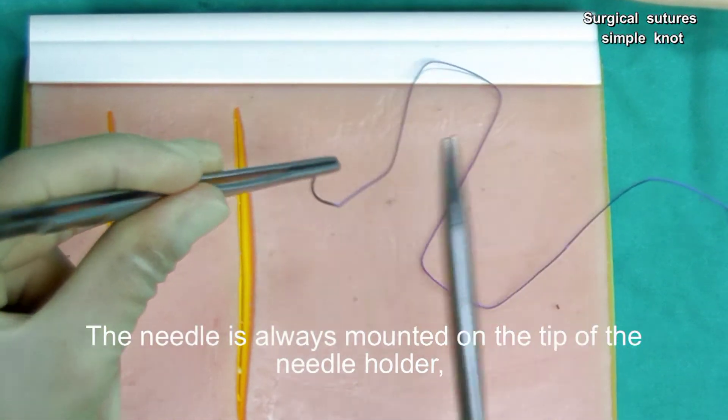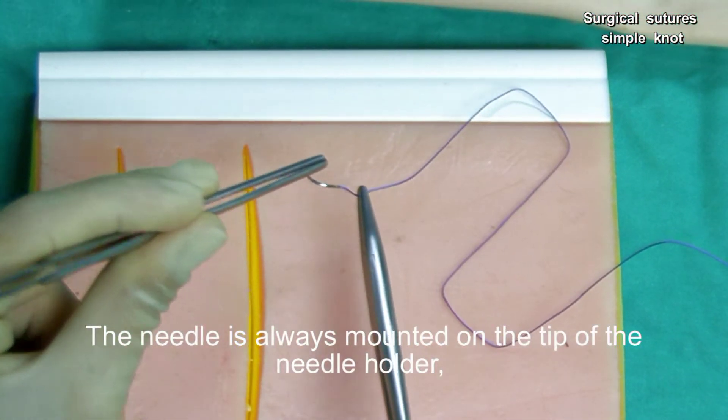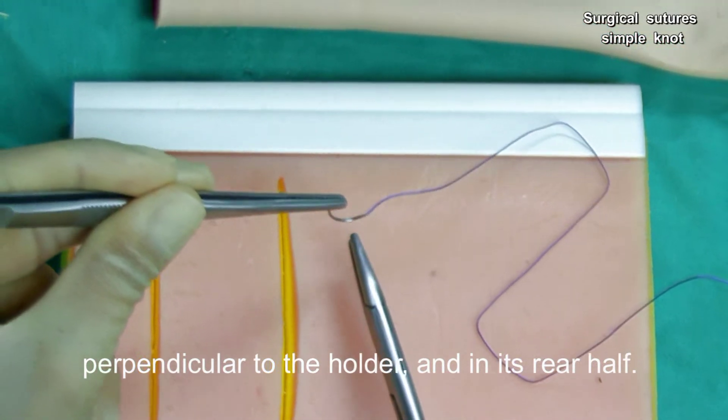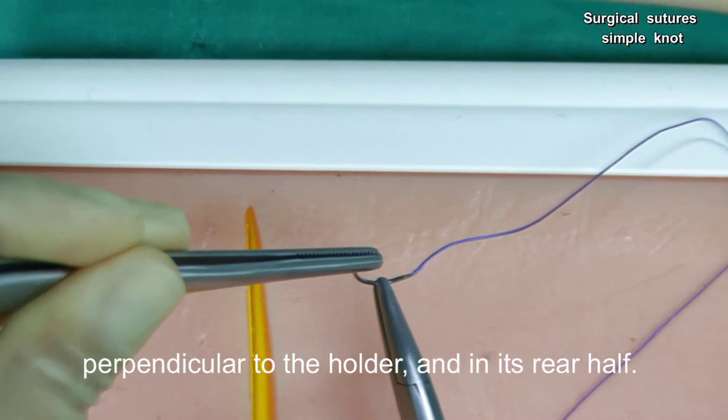The needle is always mounted on the tip of a needle holder, perpendicular to the holder and in its rear half.